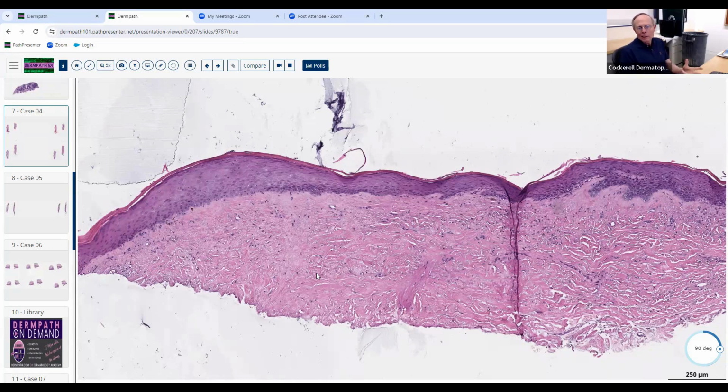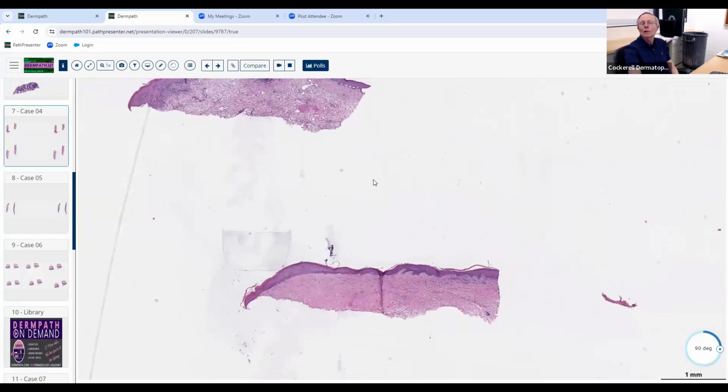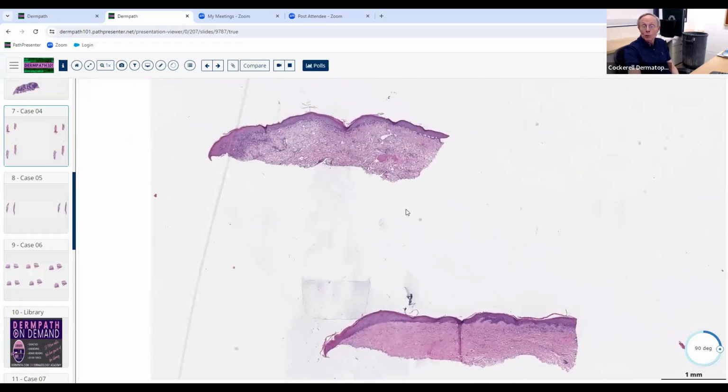Same thing with pityriasis lichenoides. You get somebody that's got histologic changes that look like Mucha-Habermann disease, and somebody that may have had pityriasis lichenoides for 20 years. So it's not really good to think about diseases in terms of the length they've been present and their histologic changes, because you can get changes that look like a relatively acute lesion and somebody's had the disease for a long time, and vice versa. So this is probably somebody that, and I don't know how long this guy's had it, I would suspect a fairly long period of time, but he's got changes of acute and chronic GVHD in the same slide. Could have even been the same lesion.